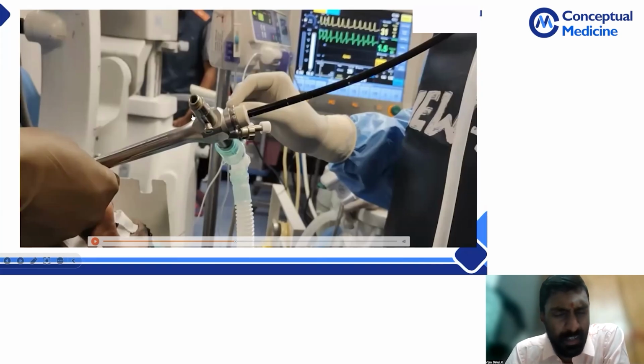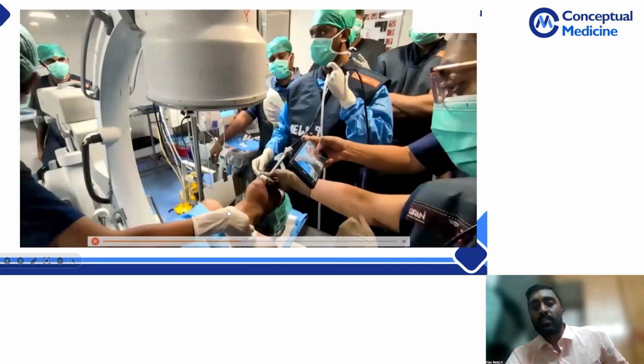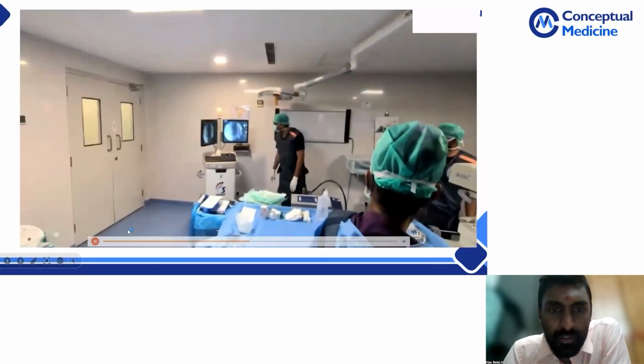This is called a prism. It has not much use. Previously, there was no light source properly in the scope. So they used the principle of total internal reflection. You adjust the prism such that light will internally reflect and you will be able to see inside. Because rigid bronchoscope or tracheoscope was used for removing foreign bodies by ENT surgeons. Mainly it was given by Chevalier Jackson. So that is the use. So they are using it here, going in and seeing it.